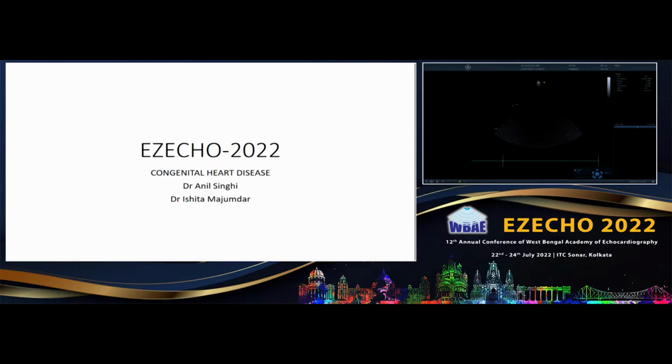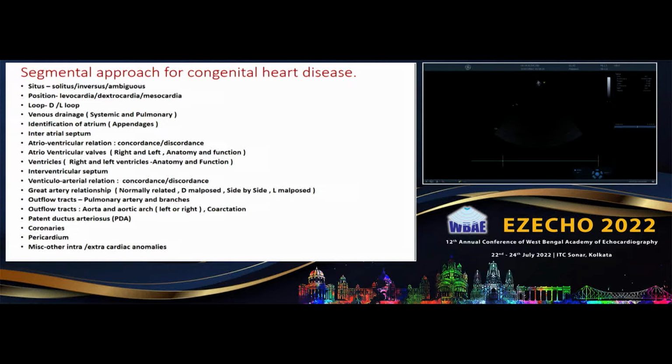Next slide, please. Good afternoon, Dr. Ghosh and everybody. I think it's very nice to have the segmental approach to start with. That is the basis of any congenital and structural heart disease program analysis.